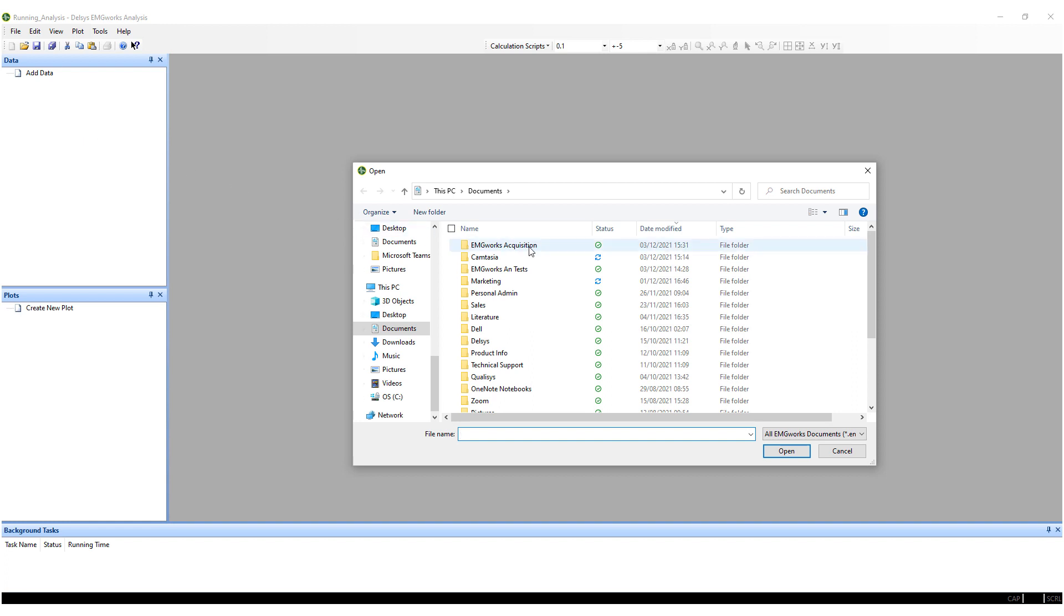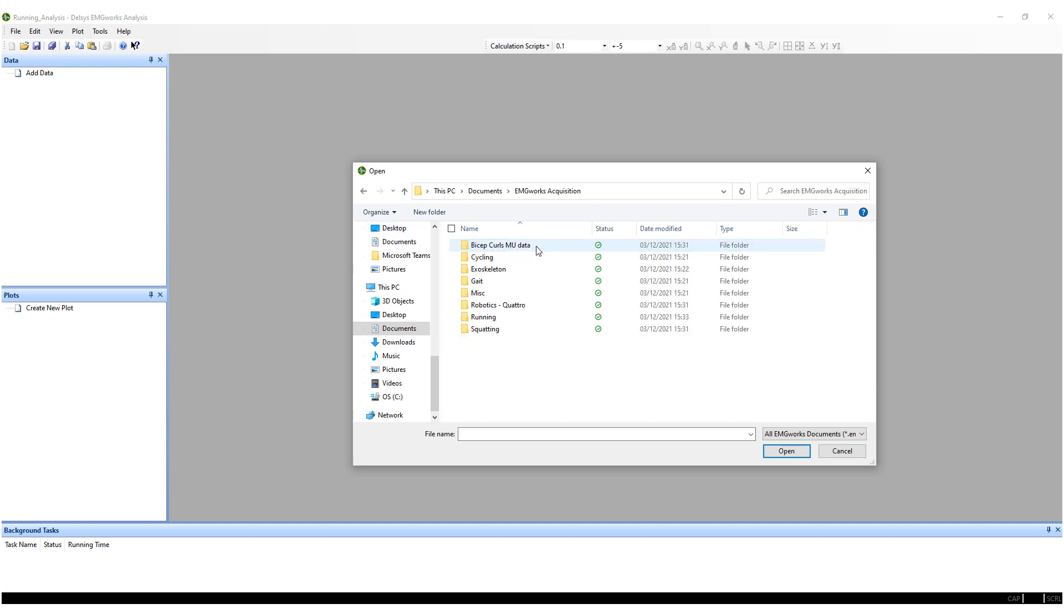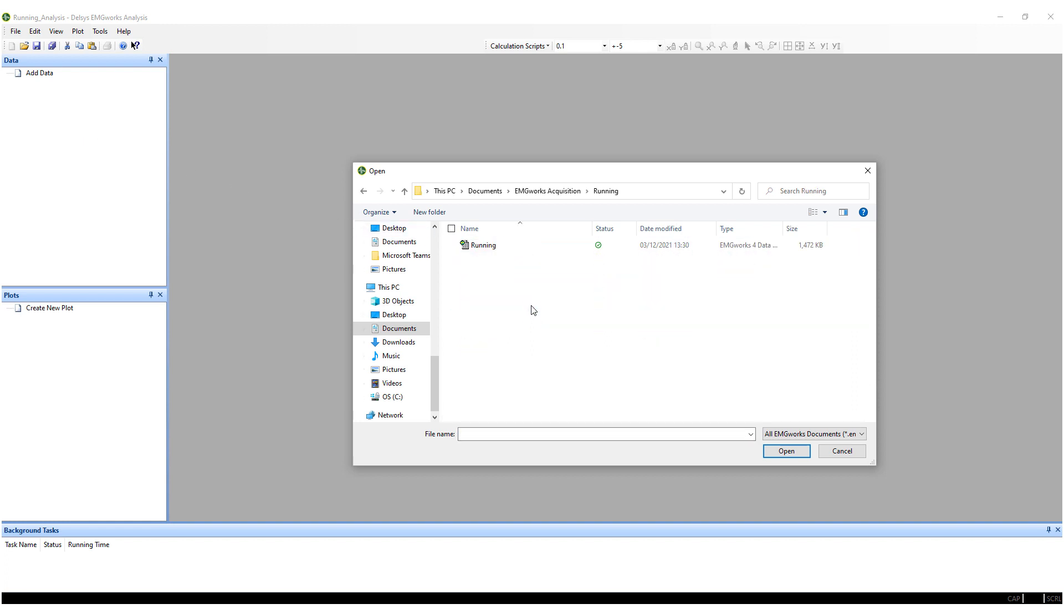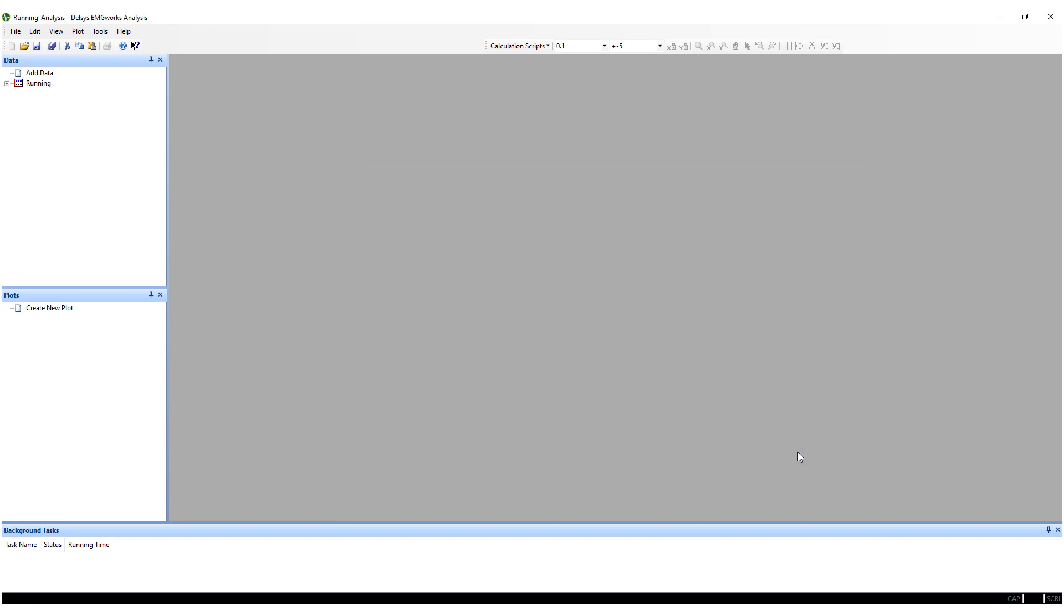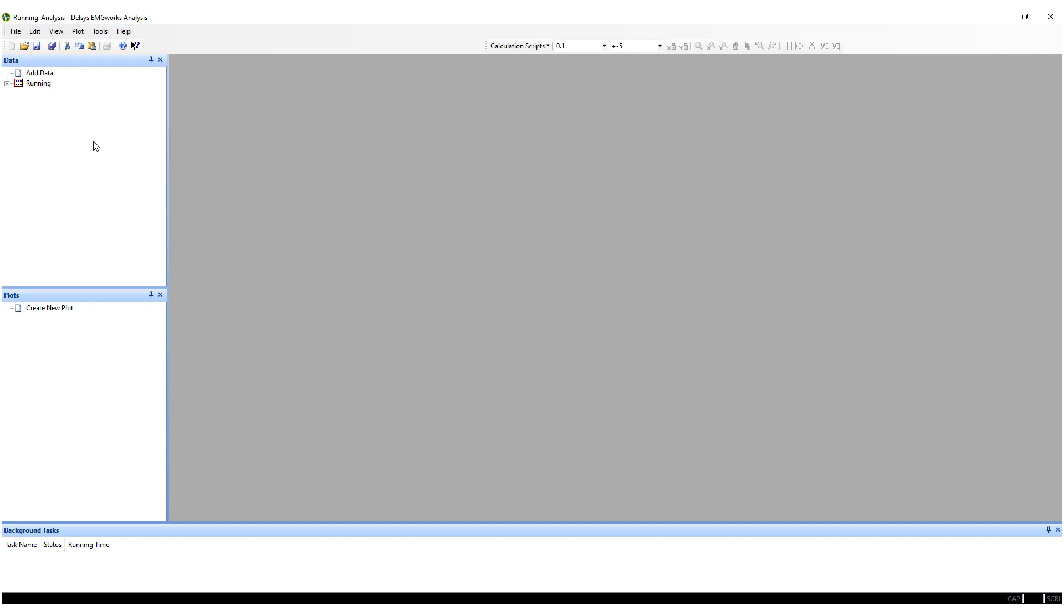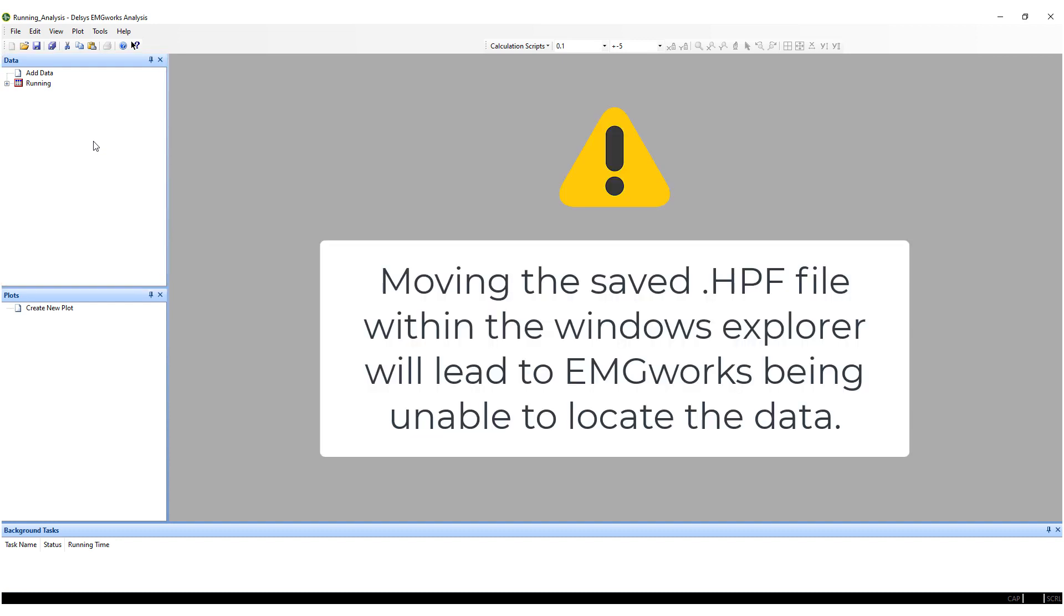This will open the File Open dialog box. Navigate to the known location of your HPF data file and select your chosen files. The HPF data file will be added to the workspace. The HPF files will remain in the stored directory.